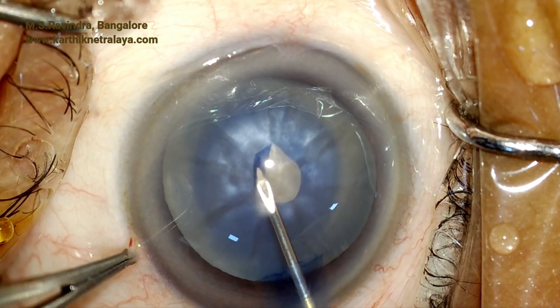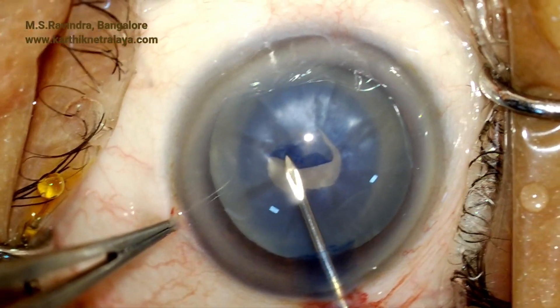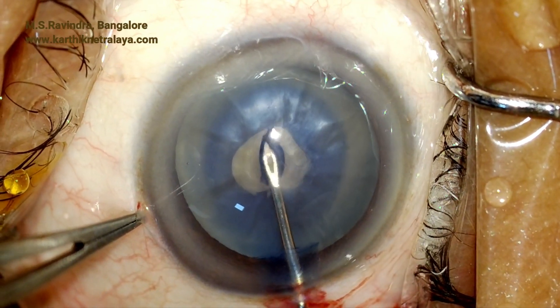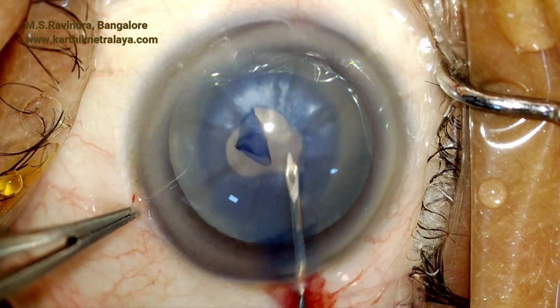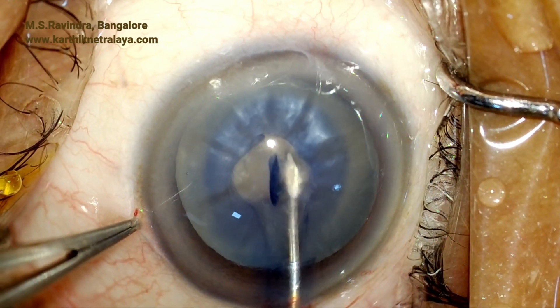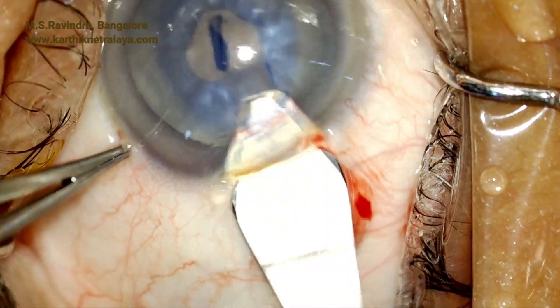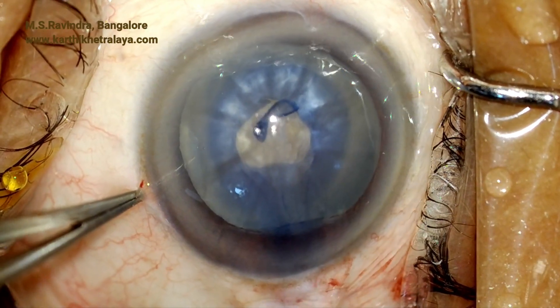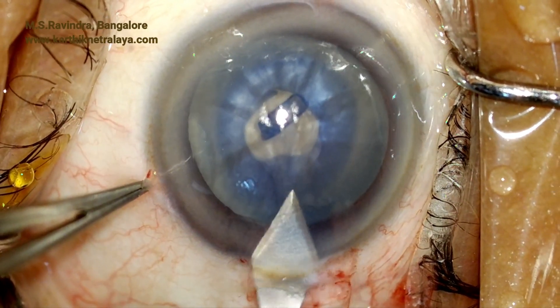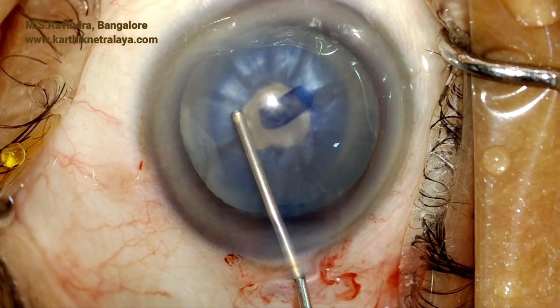The cystitome perforates the floor of the tunnel at the limbus and enters the chamber. This way the tunnel remains closed during surgery and the anterior chamber is well formed throughout. A small rhexis is created; a small tear flap is noted, and ensuring that the AC does not shallow. The tunnel is enlarged with a blunt keratome.